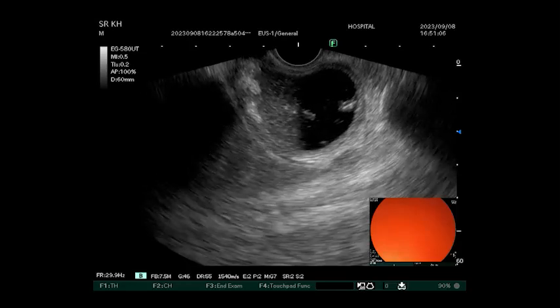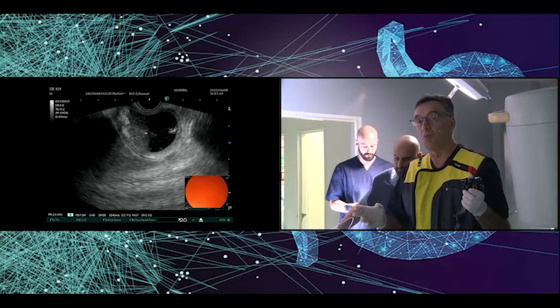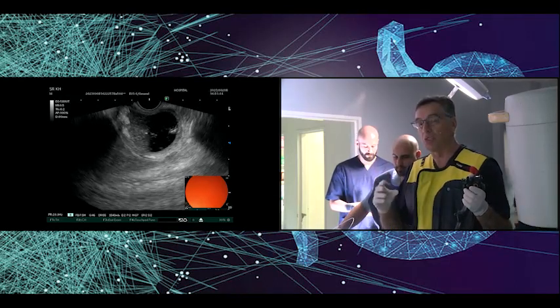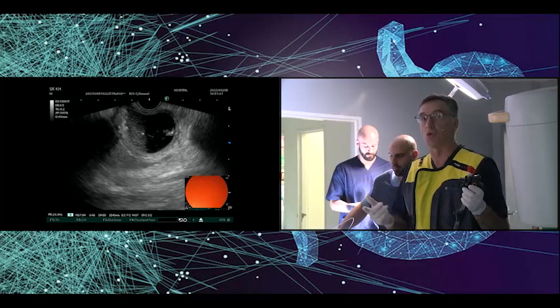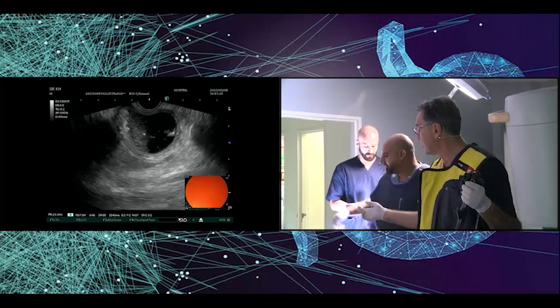About 20% of patients with biliary sphincterotomy and a gallbladder with stones left in place have symptoms. So you have to do something to the gallbladder. And here we plan, give me the stent, please.